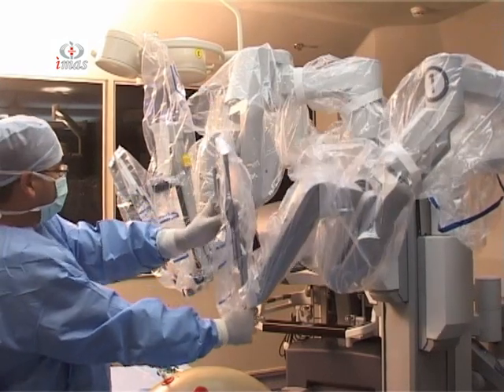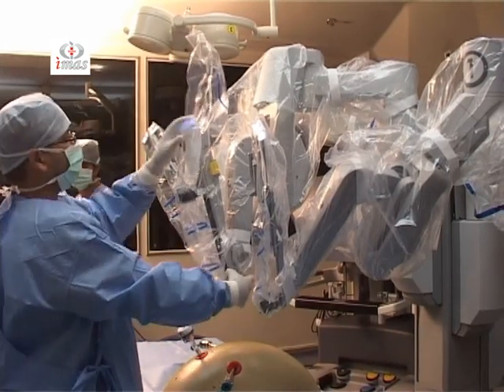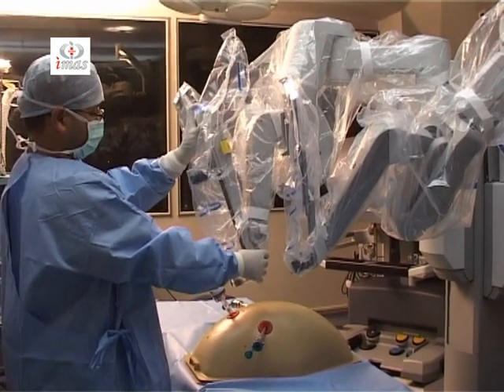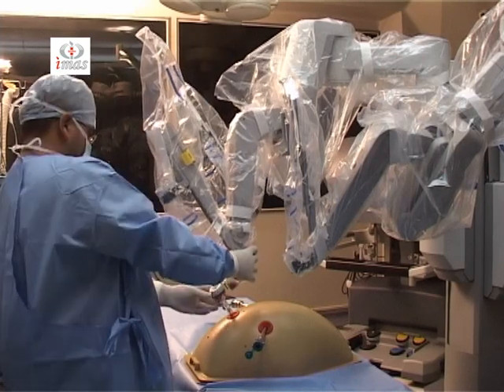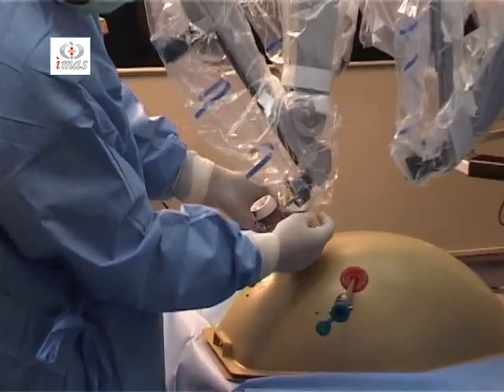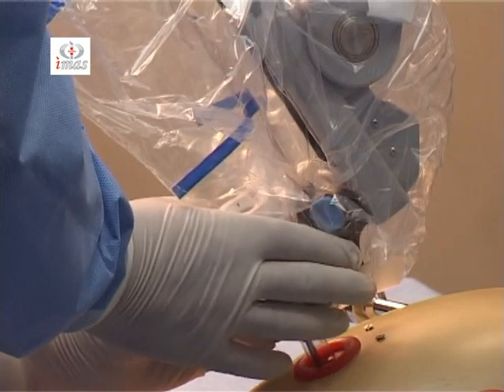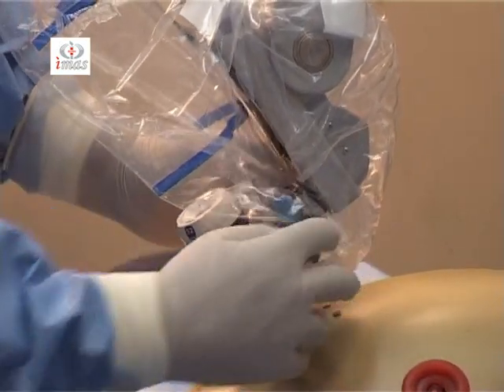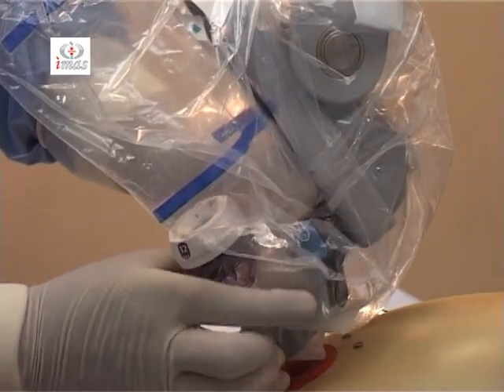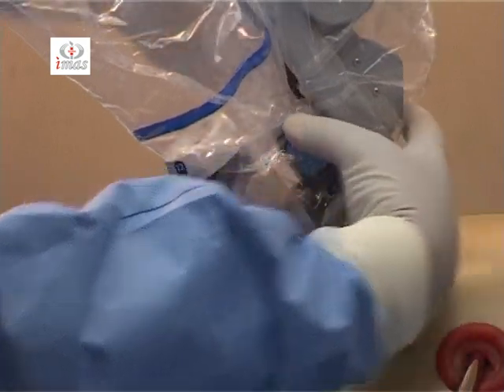Now you have to make the arm parallel to the port in order to dock it. That is, first the camera port has to be docked, and it has to be docked after making it parallel. You see that the quick click cannula mounts are open and it is well draped. And then you insert this into the camera arm by using the port clutch button and close the clip. There should be no undue pressure on the clip.